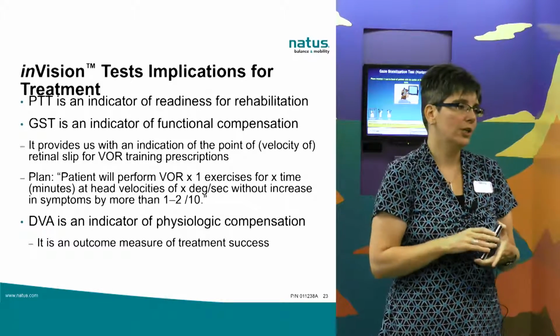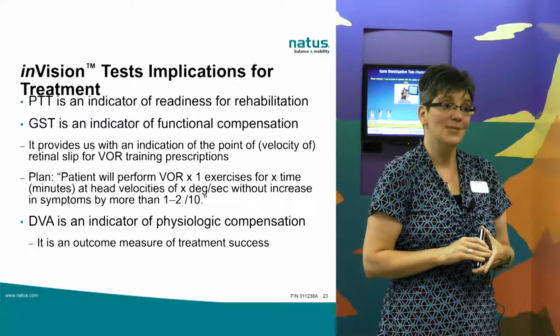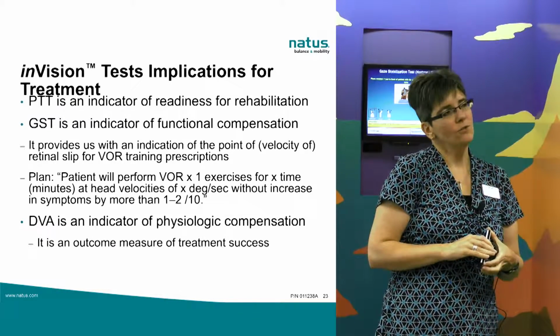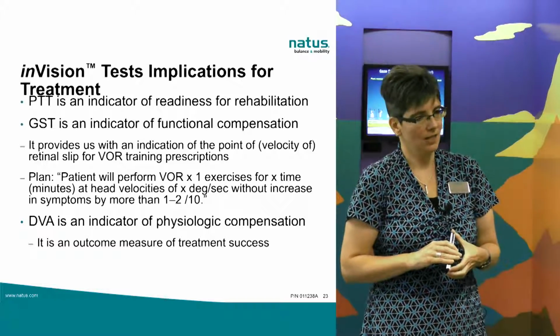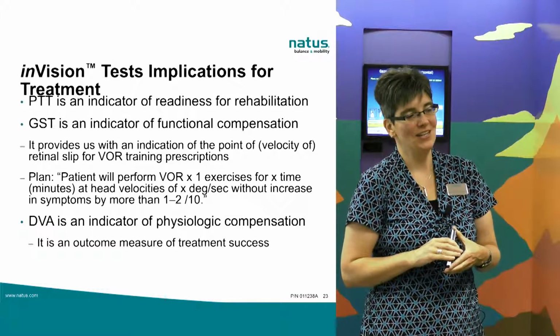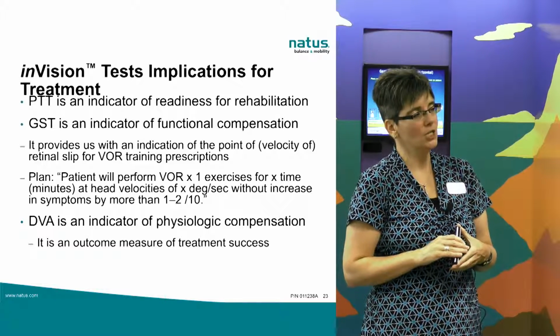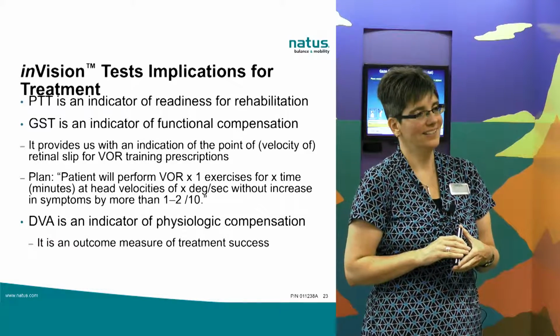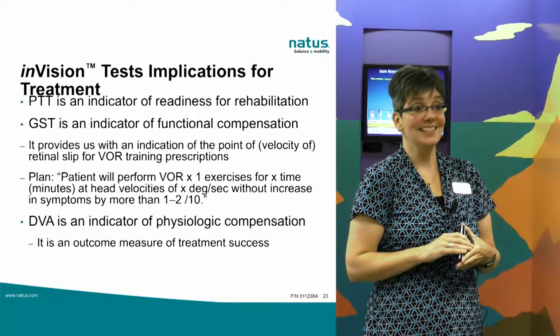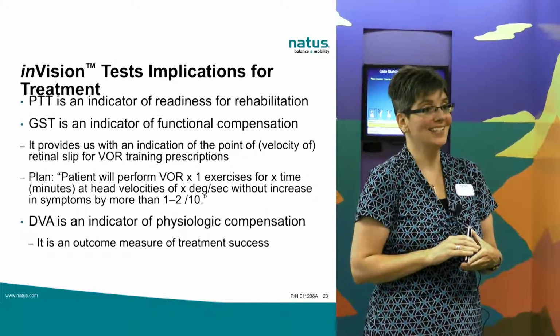Like we talked about earlier with the ability to use a metronome for training, after you test your patient and you want to set them up on a VOR ×1 training protocol, how are you going to do that? What are you going to use to help you set that up? What mode? Practice in which test?